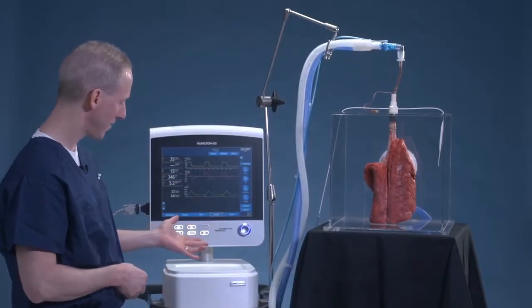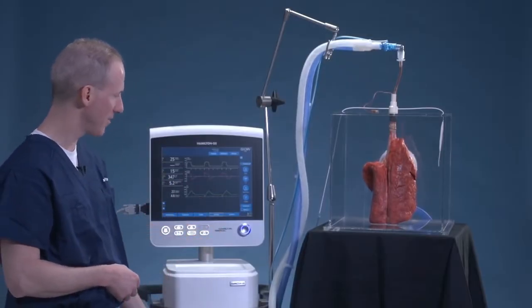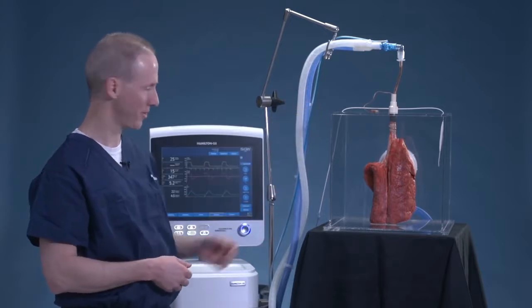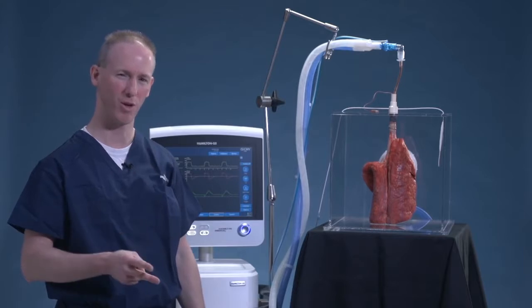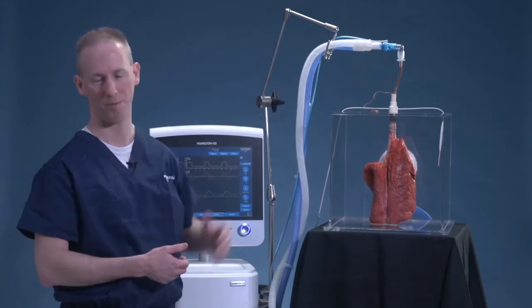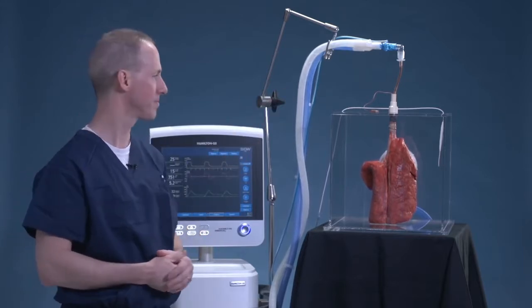As you'll notice, we have the G5 ventilator. We have an esophageal line that's going to our esophageal catheter. We have a proximal flow sensor that's capturing the most accurate pressures, flows, and volumes, all where it happens, right at the interface of the ET tube.